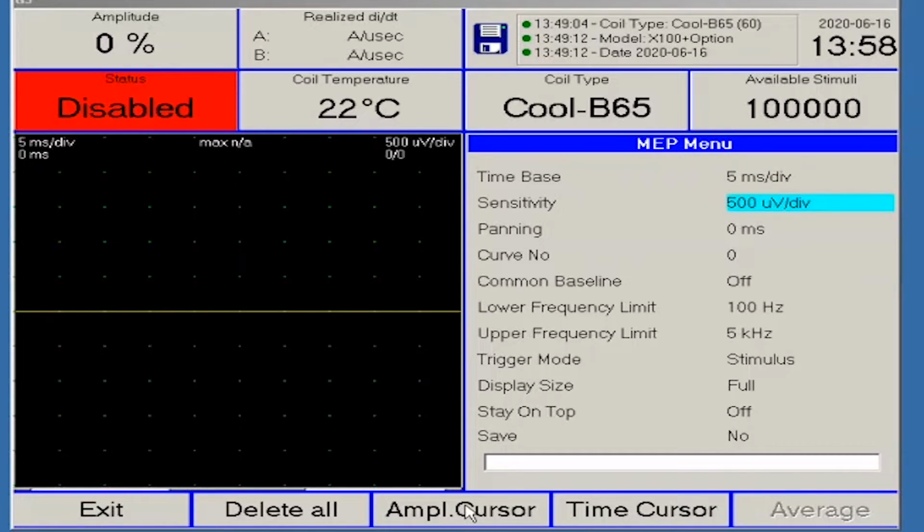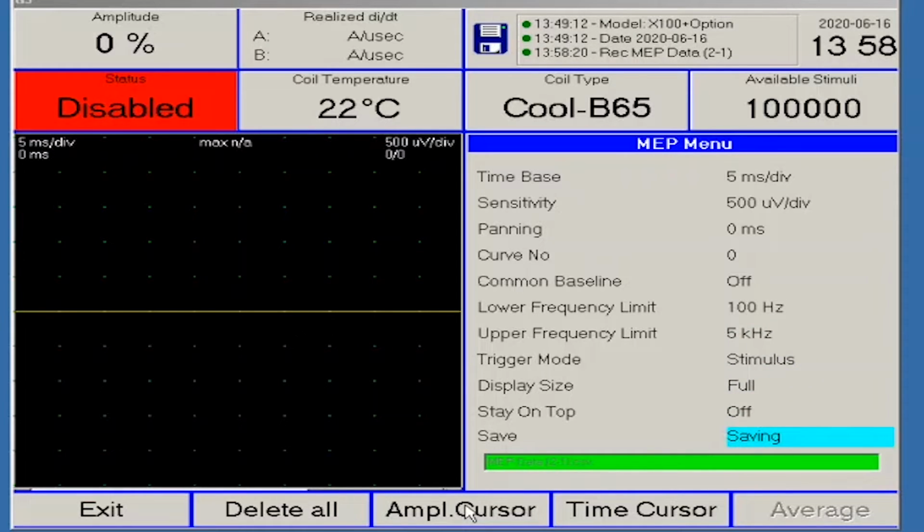I have to emphasize that if your response is larger than the screen, the cut-off responses will be saved, not the full traces. But you can change the different values, and you can also go in and save the protocol under a name, and you can then open these files, and if you have a USB stick, you can store it on that.